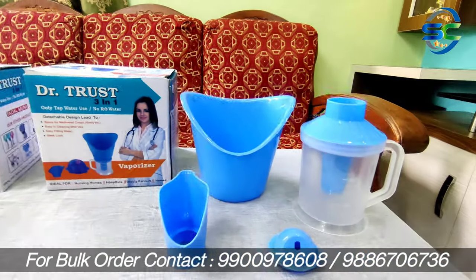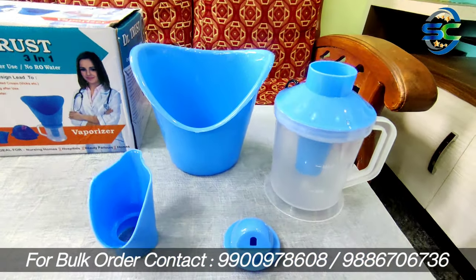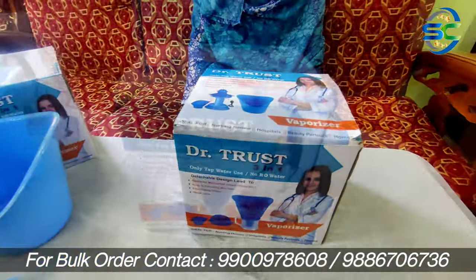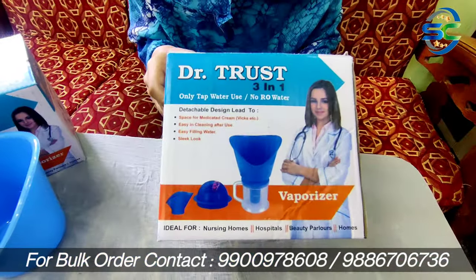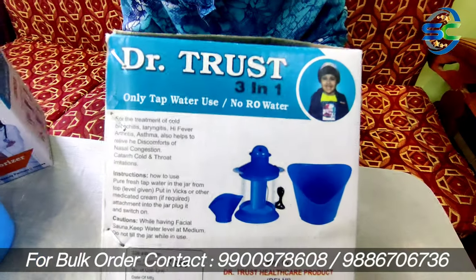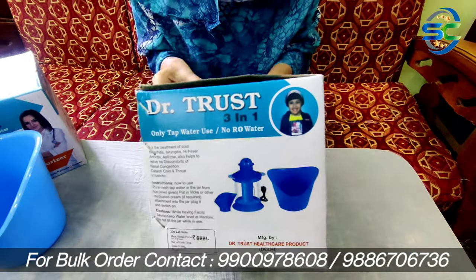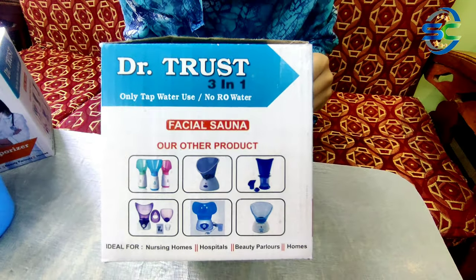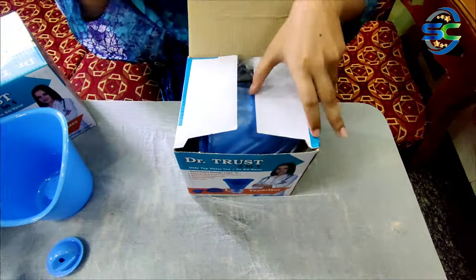This vaporizer is easily available in the market and online. It is easily available for 300-400. For me, this is a basic machine that needs to be in every house, because of cold, cough, and COVID-19 — so this machine needs to be in every house.